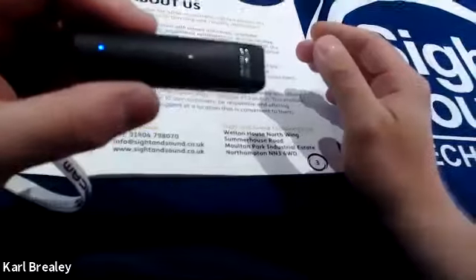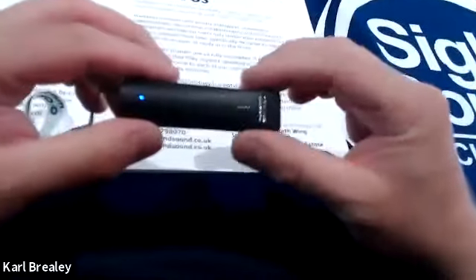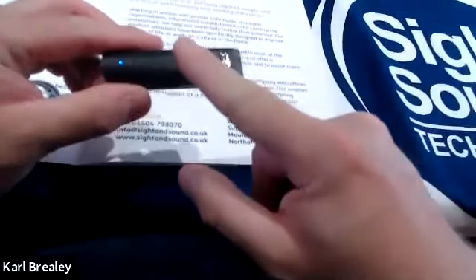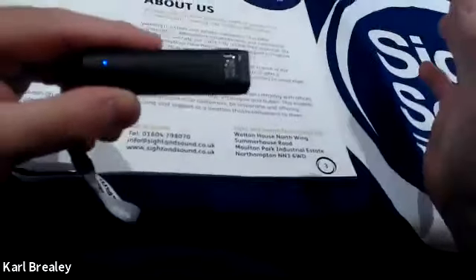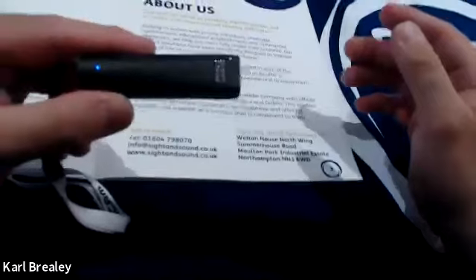Volume down. Volume up. I don't know if you can hear that little clicking as it's doing it. That's just giving you the reference that it's actually doing something. Now, from this little sensor bar, I can touch it just by gently tapping. And you'll hear there, it took a picture. It won't capture anything because it's pointing at my sink at the moment. So hopefully there's no text over there.